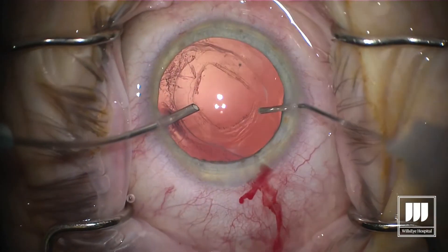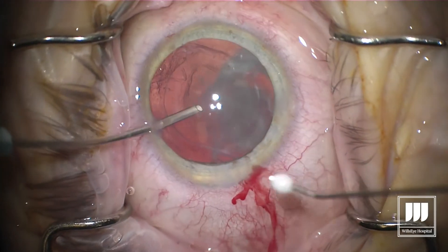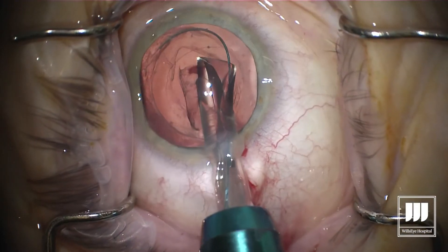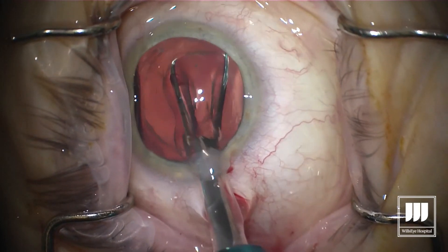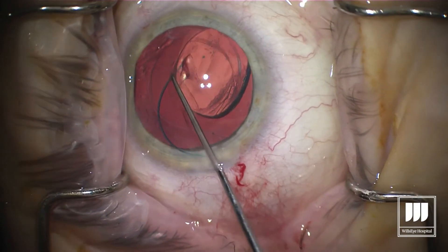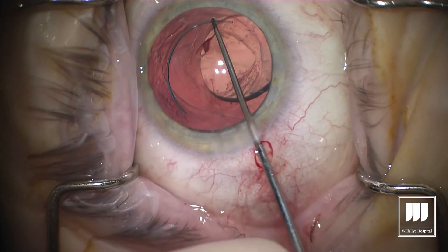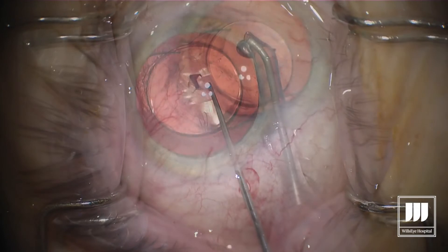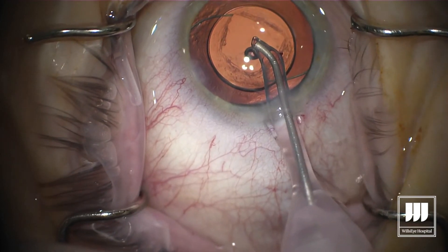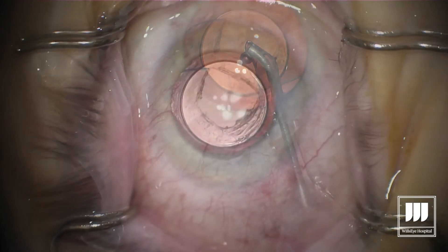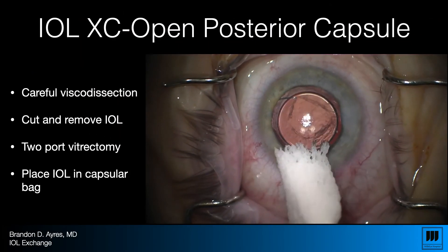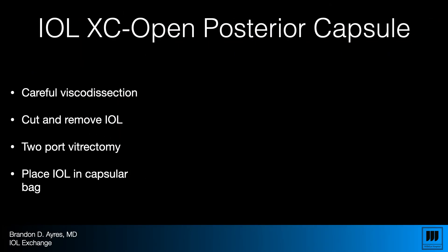We do a vitrectomy. Notice we have not disturbed the posterior capsulotomy, and we have an intact capsulorexis. Using triamcinolone and a two-port vitrectomy to check for vitreous. Here I'm actually able to use a three-piece IOL and put it right into the capsular bag — not the sulcus, but right back where it belongs. This is an open posterior capsule IOL exchange with an in-the-bag-for-in-the-bag placement. I used a three-piece IOL because I never imagined I'd get the implant out without disturbing the posterior capsule — but in this case we were able to.